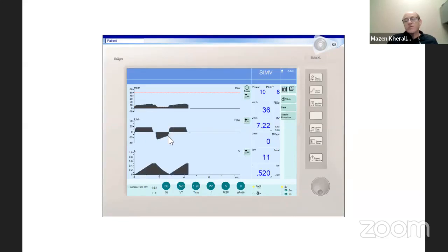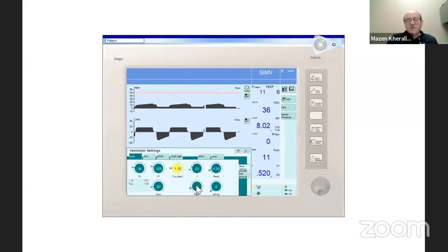See, I'm cutting it off. So this patient is not asthmatic, so you need to avoid having persistent flow. And if you want that high minute ventilation for the patient, if you want that 22, just deliver fast, eliminate any auto-PEEP here, increase the flow, deliver the tidal volume faster.